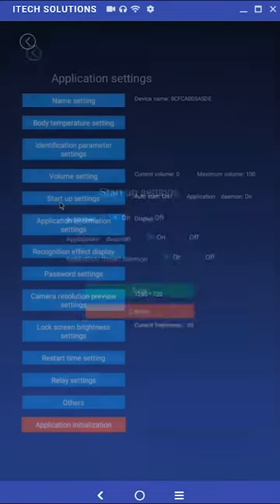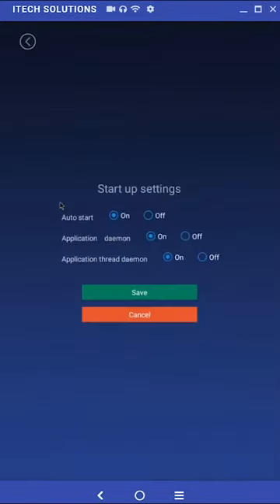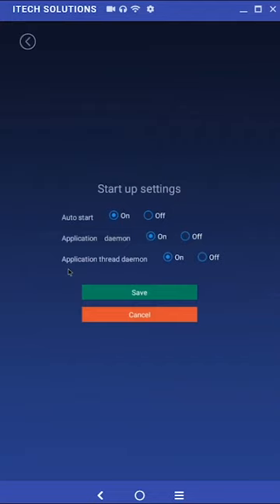Startup settings. Here are three options: auto start, application daemon, and application thread daemons. These settings are what sets the application to automatically start upon startup or to start after one minute of being on the android desktop. You can turn all the settings to off to disable the application from automatically booting.